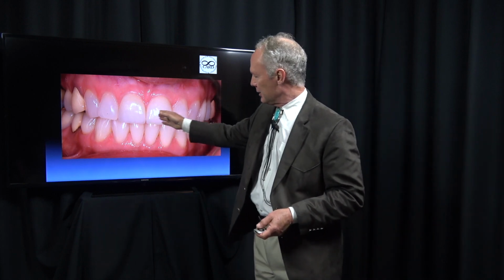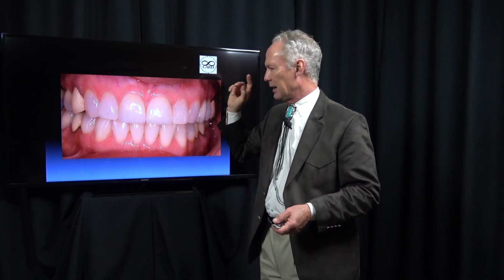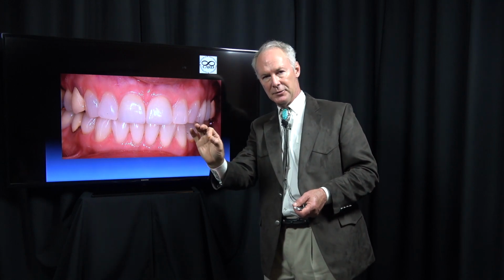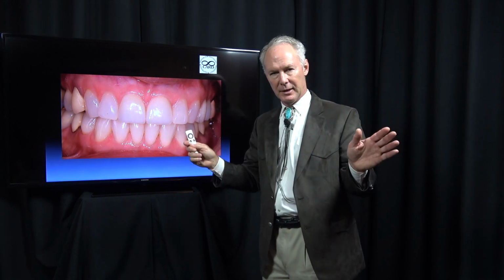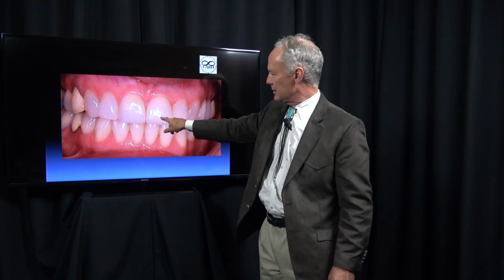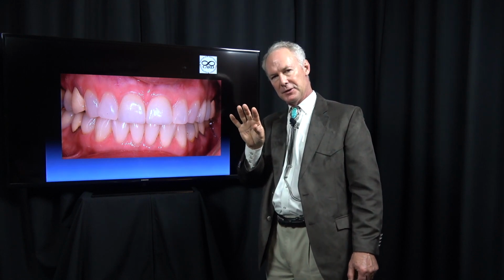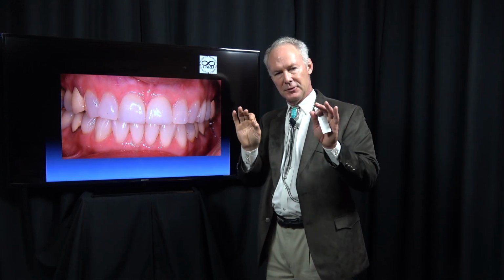If there is a big shade differential between the veneer and the adjacent teeth when you try it on with no cement, don't cement it. This technique is for cases that have just a tiny little variation in shade and you want to influence it just a bit with the cement.